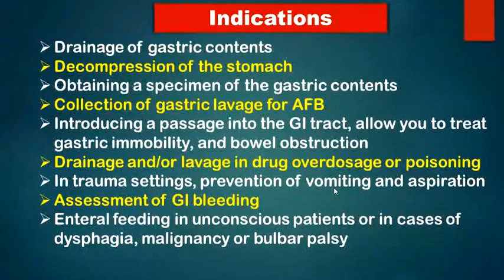So we start the enteral feeding by introducing the NG tube, or sometimes we call it the OG tube, through the oral cavity, through the mouth. And we start giving the trophic feeding through the NG tube and increase the amount gradually according to the response of the patient, before the patient becomes ready to take direct feeding. So this is in neonatology, which happens daily in the NICU.